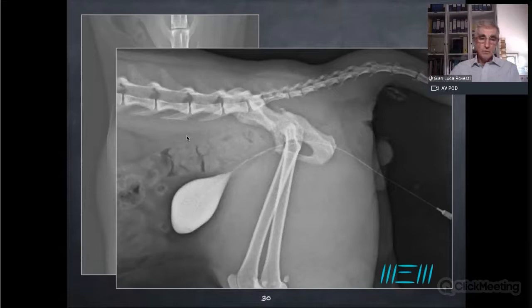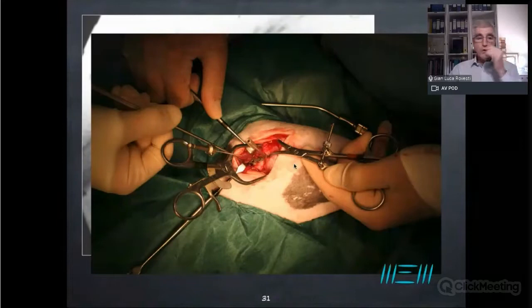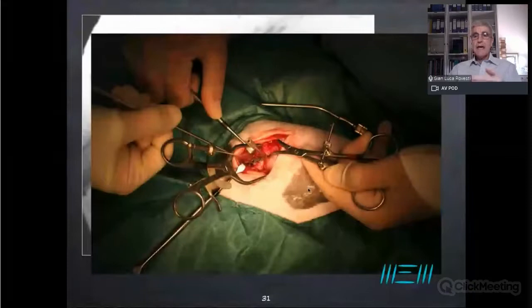And I think, this is my personal conviction and my personal thought, that if we stabilize the pelvis, we will reduce the likelihood of having more neurological complications, because sometimes you realize that it is the movement of the pelvic fragment that will damage the roots of the nerve. Okay, so this is my suggestion to the owner. In this case, of course, we had to perform three positionings during the surgery, because we had to perform the first approach in lateral recumbency for left ilial wing stabilization, and then on the opposite side for right stabilization, and then sternal recumbency for overall stabilization of the pelvis, okay?